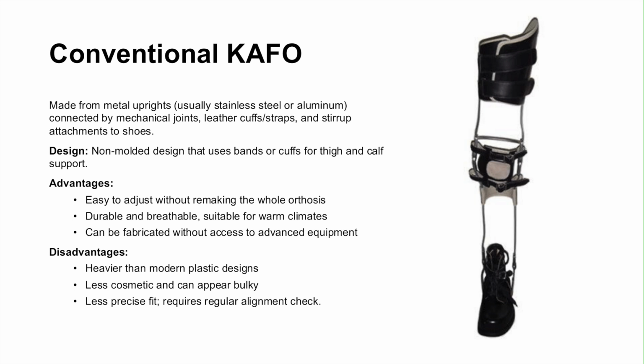So conventional KAFOs are often for long-term users who need durability and adjustability. It is made up of metal. The metal upright can be bent or altered during follow-up visits. The shoes are directly attached to the metal, and it may incorporate drop locks or bail locks.